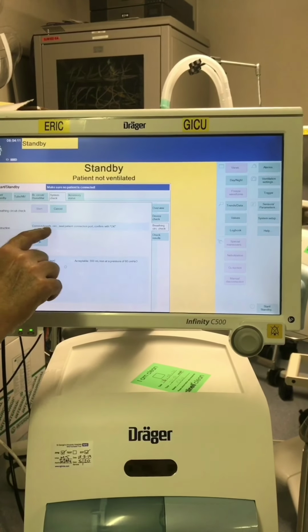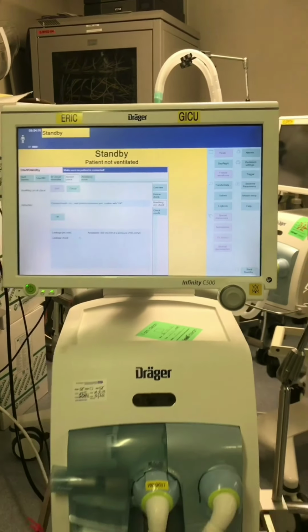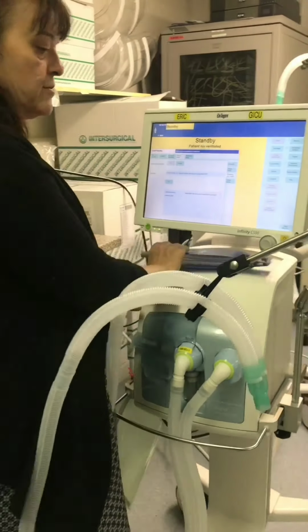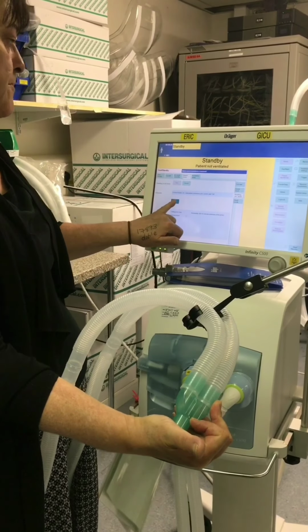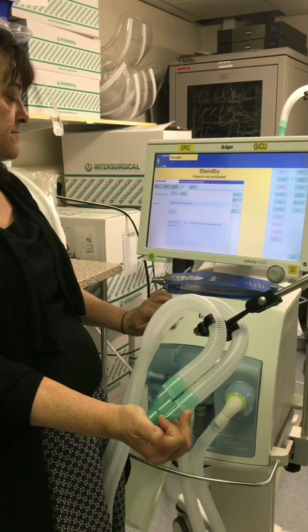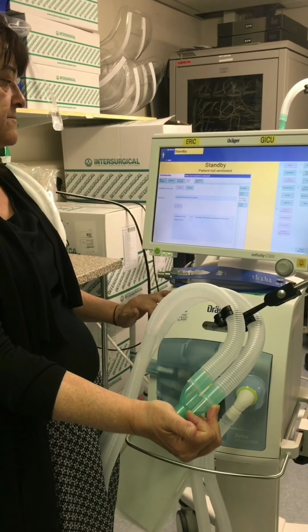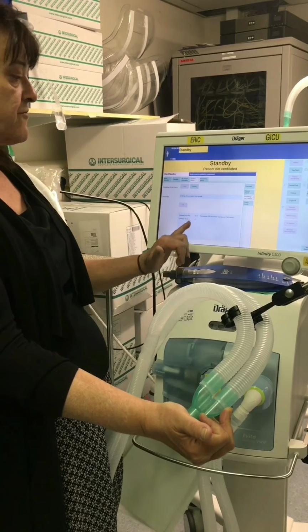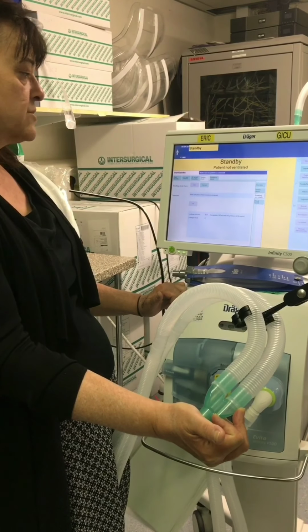It's now asking me to seal the port, which you can do with your hand if you can't find a bung. It's just measuring the leakage here. The acceptable leakage is 300 mils per minute at a pressure of 60 centimetres of water.